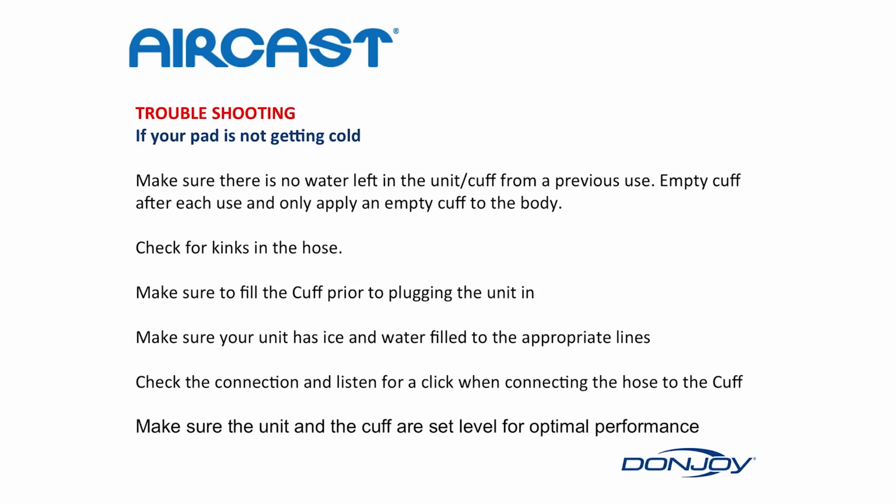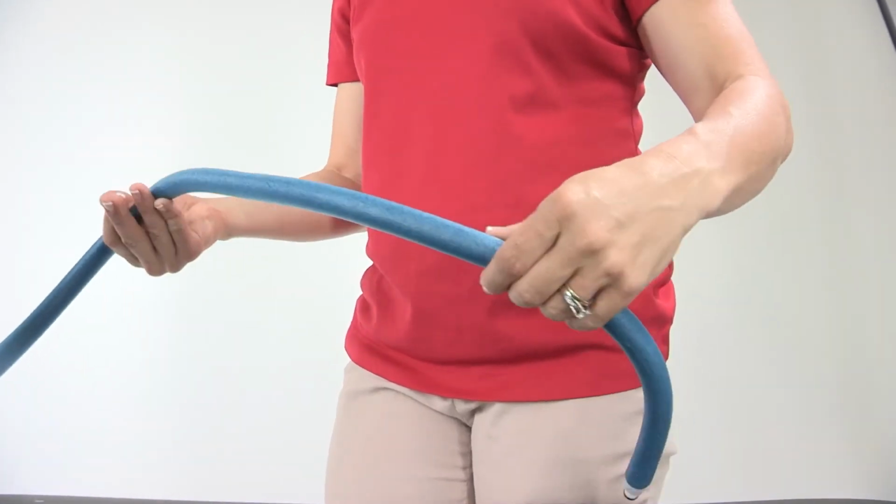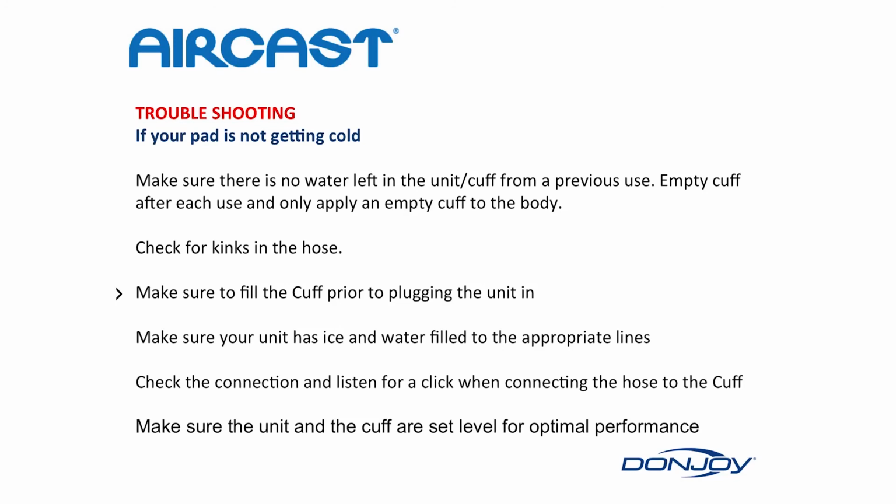Troubleshooting: if your pad is not getting cold, make sure there is no water left in the unit or cuff from a previous use. Empty cuff after each use and only apply an empty cuff to the body. Check for kinks in the hose. Make sure to fill the cuff prior to plugging the unit in. Make sure the unit has ice and water filled to the appropriate lines. Check the connections and listen for a click when connecting the hose to the cuff. Make sure the unit and the cuff are set level for optimal performance.